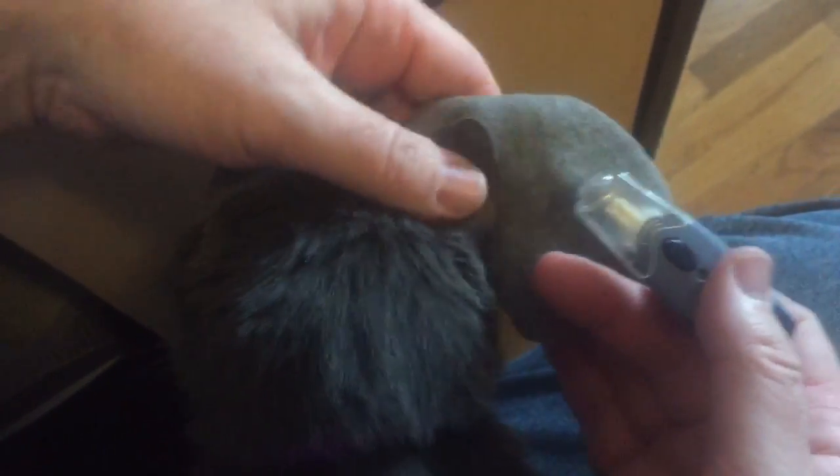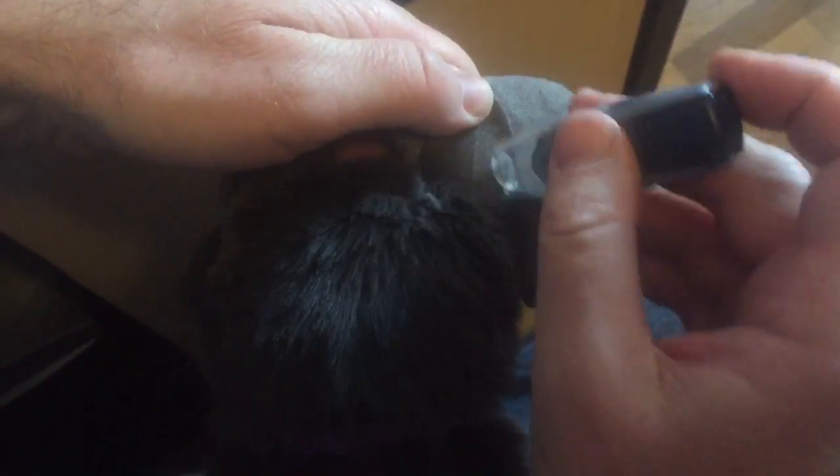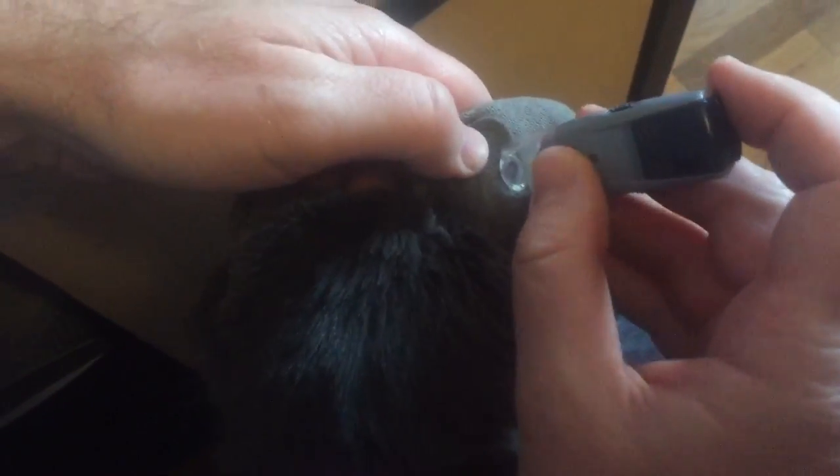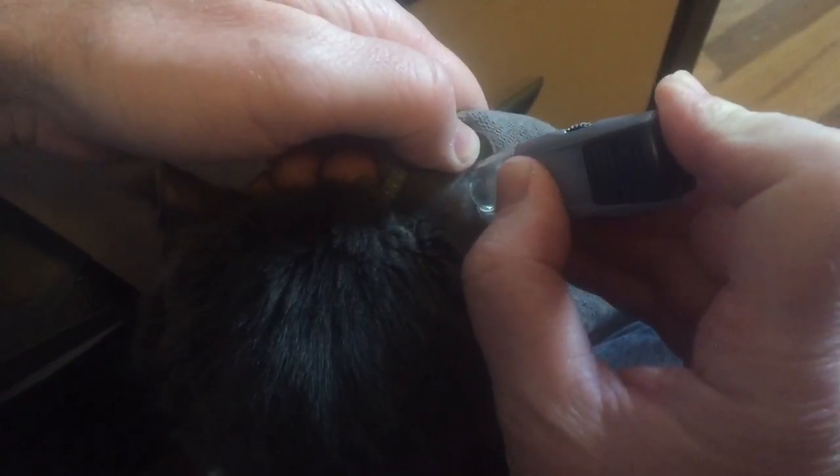My finger is on the backside just holding it, my other finger is holding the ear, and I'm using my elbow to kind of keep Kitty in place. You make sure you pull back on this like a trigger, loading a gun or something. Hold that down. Usually right around this area is best — not too far down, not too far this way, right about here. Hold it there, pressing a little bit, not super firm.